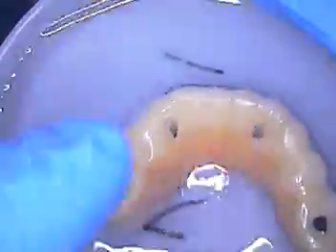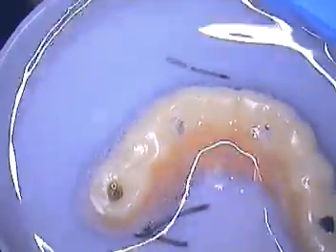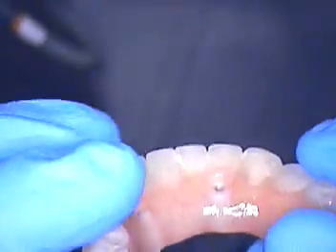So we just put that in peroxide. So we have a little dish here, and we can label them room 1, and in it goes, and it's bathing in that peroxide. Alright, so after we finish the case, this temporary will be dried and put in a safe place in case our patient ever needed us to put this back in for any reason. Now here's the final, and we're ready to go in with that.